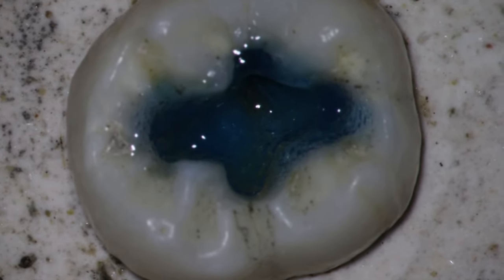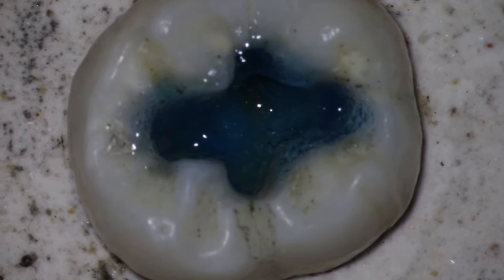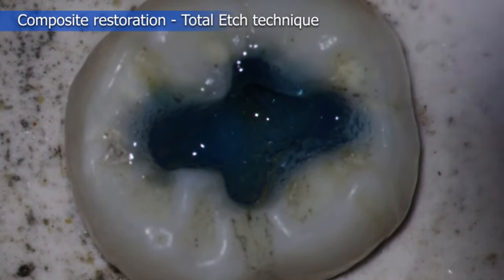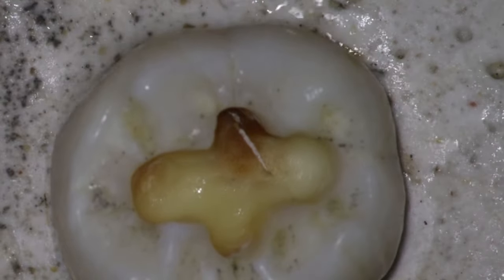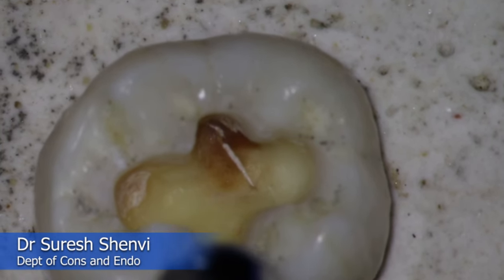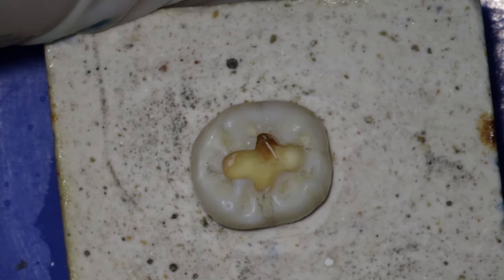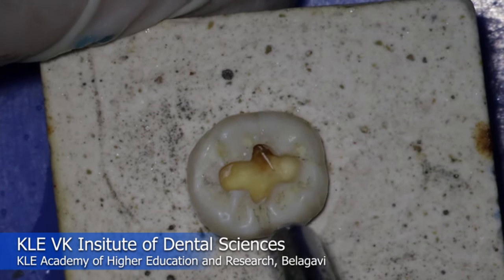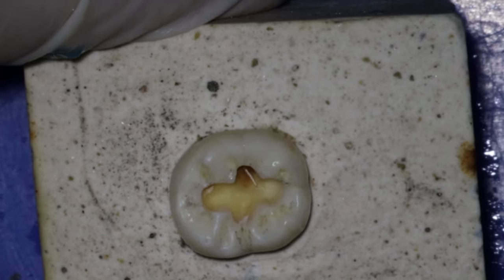So washing is very important. So we are almost past the 15 seconds now, and we'll try to wash it. So I hope you can clearly see. After etchant application, it appears white, the appearance which indicates that the etchant has worked very well. You can see there is a white frosty appearance everywhere.